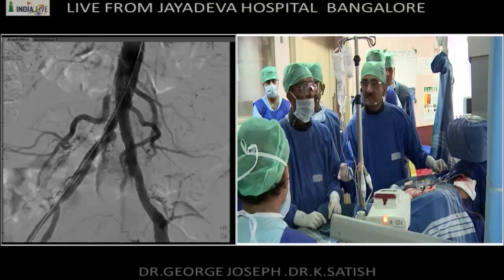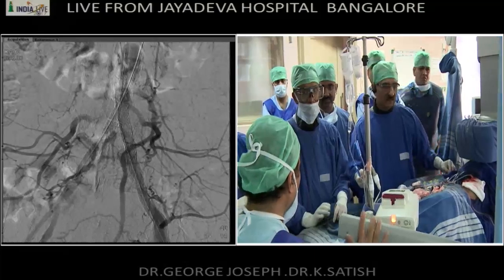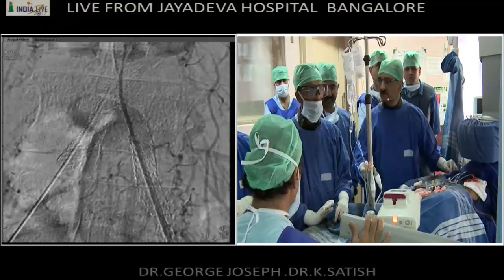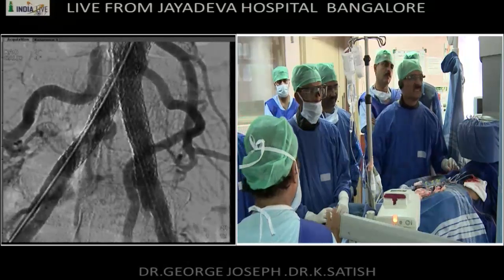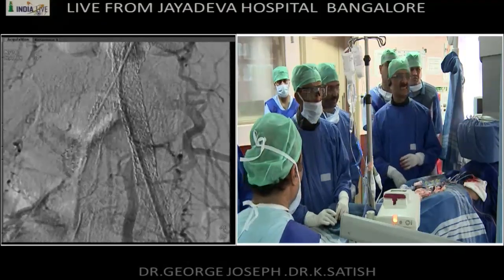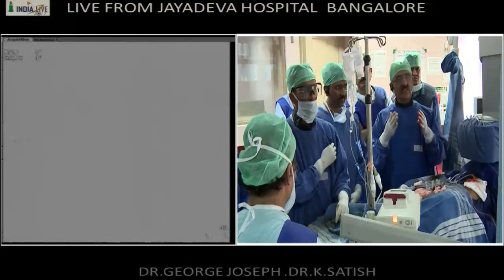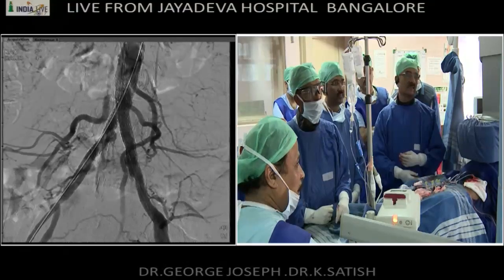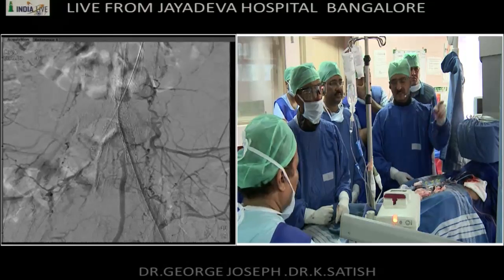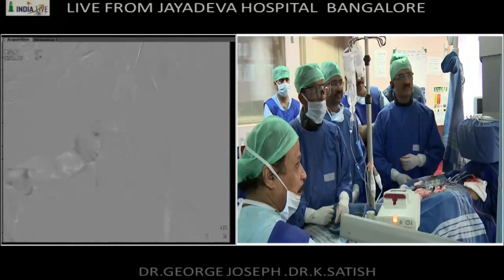What about 9 or 10? Nothing beyond 10. So you want to extend it into the internal iliac? Yes, because the original CTO ended at the bifurcation. But you can see there's a small distal part of the external iliac.